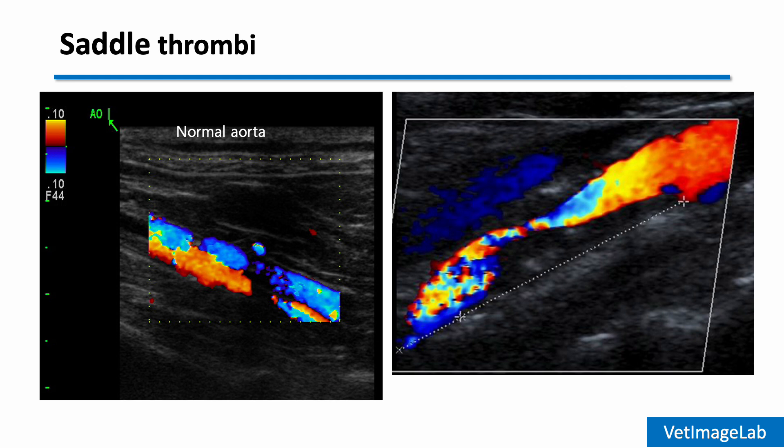On the left, you see a normal aorta filling with clear laminar flow, extending into both external iliac arteries. On the right, the flow is disrupted with turbulent signals, indicating an obstructive saddle thrombus at the bifurcation. This condition leads to acute hindlimb paresis, pain, and frequently poor prognosis in cats with HCM.